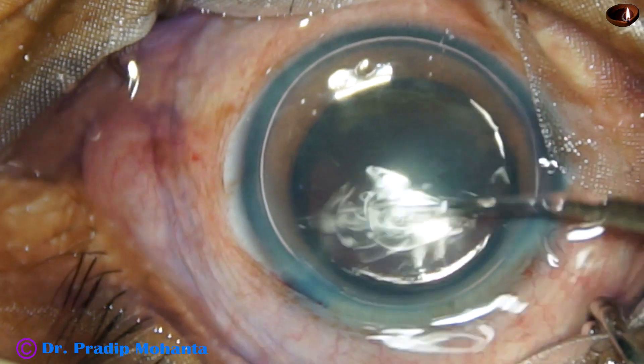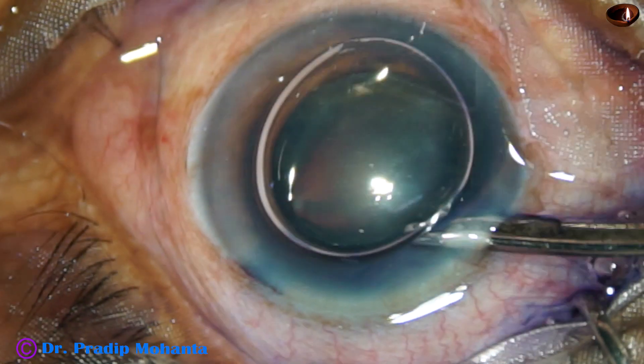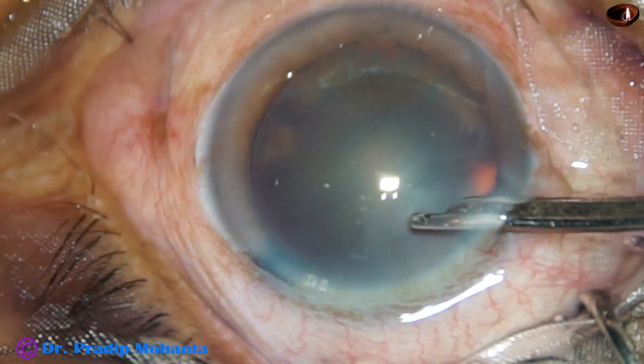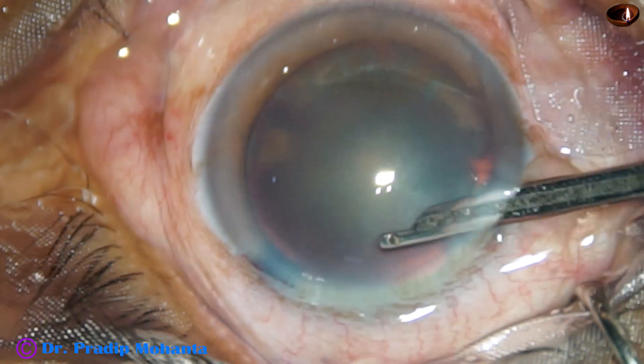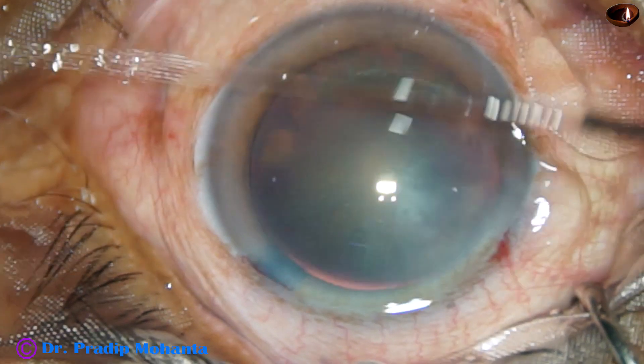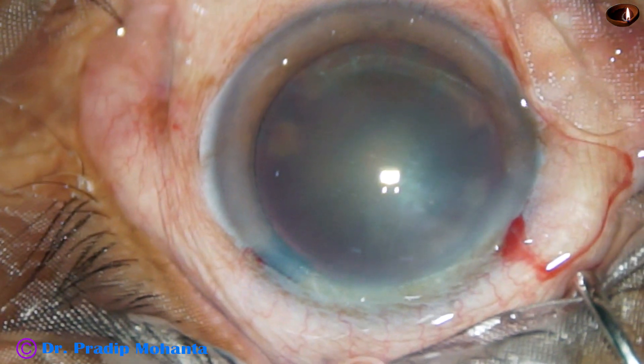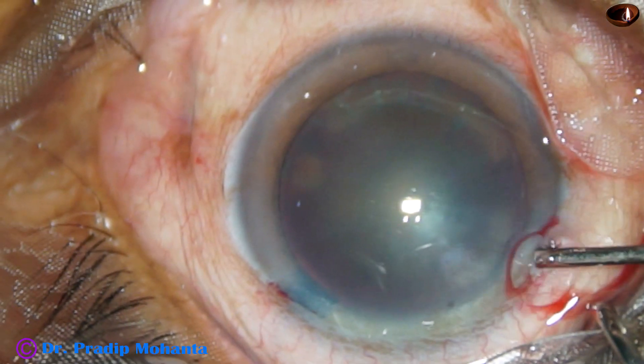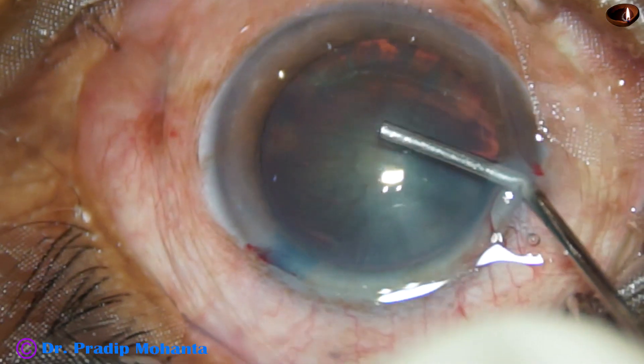The dye is then washed out with BSS. In this case, only one side port has been made. And 2% HPMC is then injected into the anterior chamber.